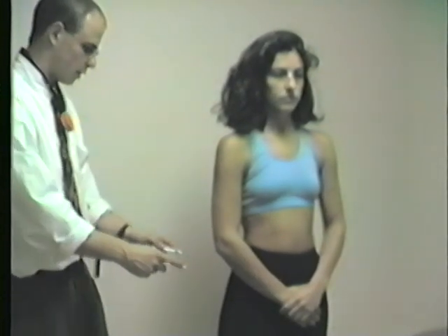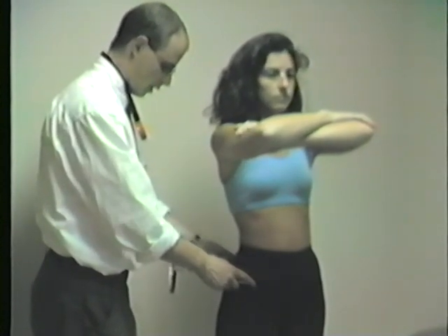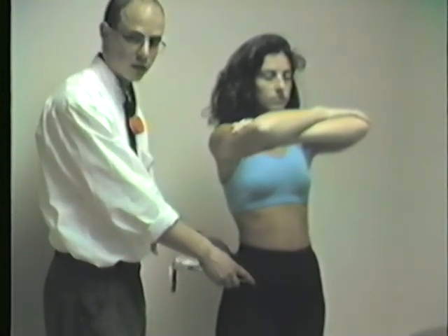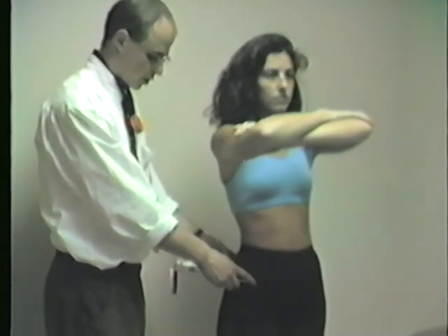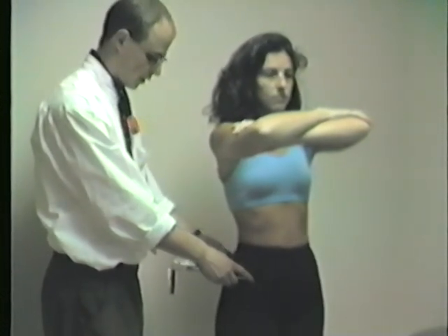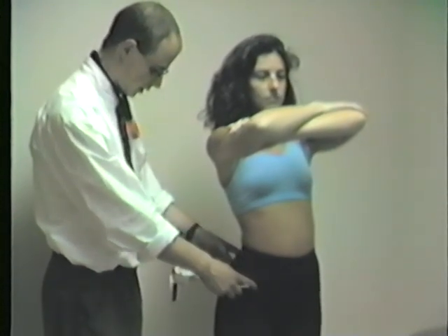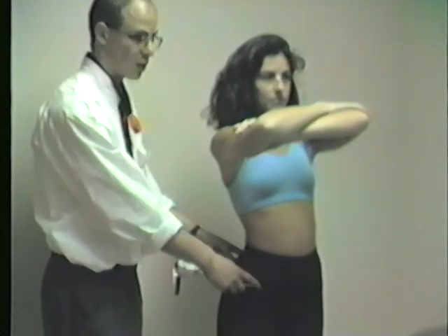Of course, I could also go ahead if I just want to measure — for example, if I do postural re-education and I just want to see how many degrees of pelvic tilt this patient stands in — I can record this, and later record if the patient improves, as well as measuring range of motion. So Cheryl now does a posterior pelvic tilt, and she is about at 12 degrees there, and then she does an anterior pelvic tilt and goes to 16 degrees in the other direction. That gives me the range of motion.